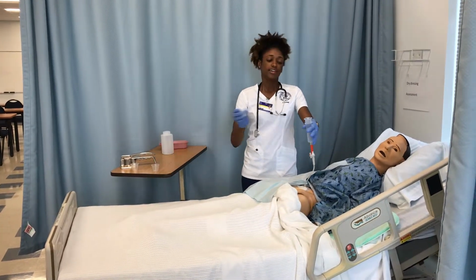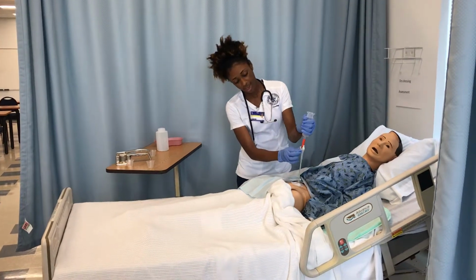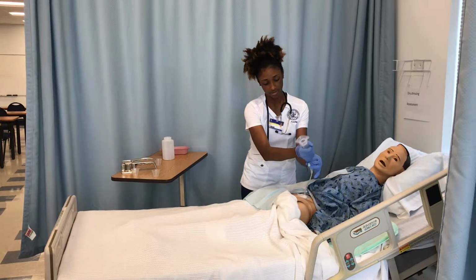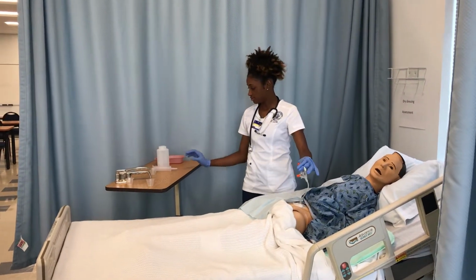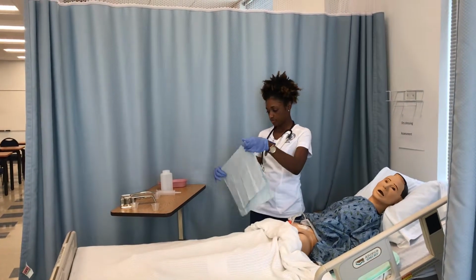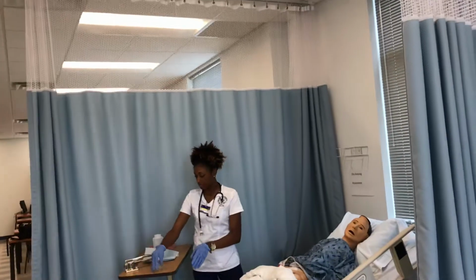And then I would continue with administering the nutrition. Once that's done, I'm going to flush it with 30 milliliters of water again, and then I would close the valve, remove the syringe, and make sure my patient's comfortable, and after that, begin to document.